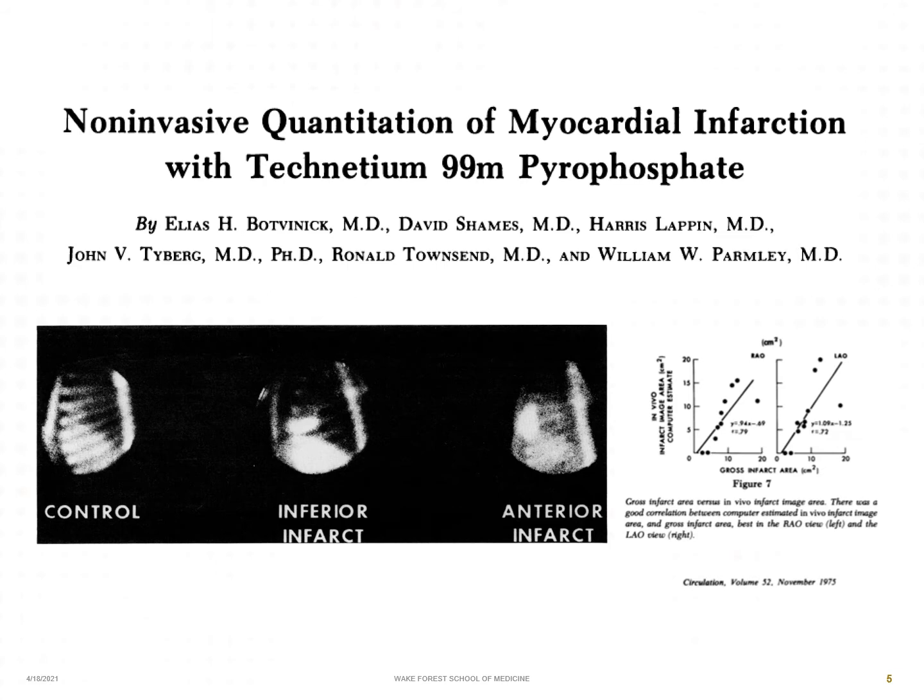Part of the healing process of some of the injuries to organs is the ability to form hydroxyapatite crystals and generate calcification. Technetium-99m pyrophosphate binds to calcium that is liberated by the injured cardiac cells in myocardial infarction, as is illustrated here in this research study from 1975. As you can see on this slide, control subjects with no infarction do not have any significant pyrophosphate uptake, while patients with an infarct to the inferior wall and to the anterior wall clearly show uptake of pyrophosphate labeled with technetium-99m.